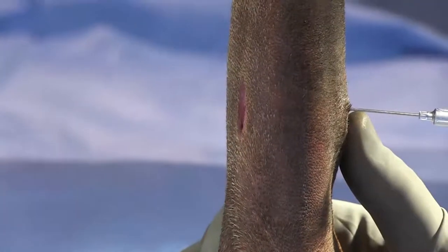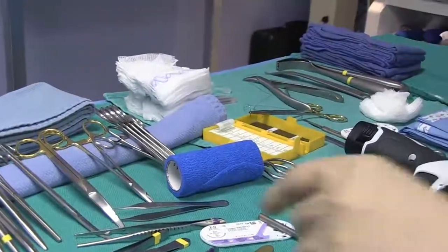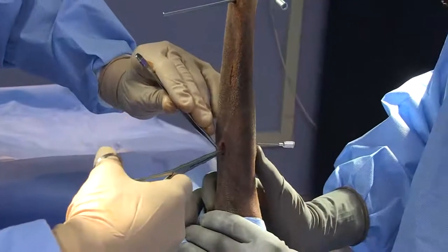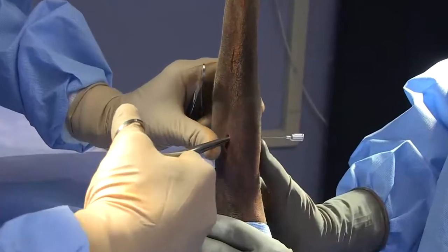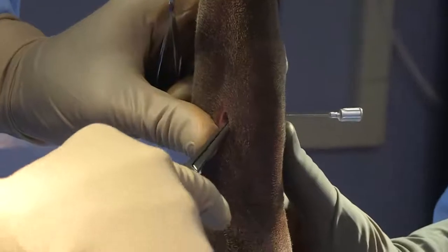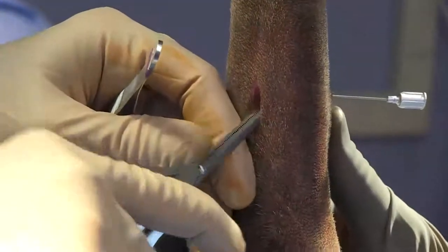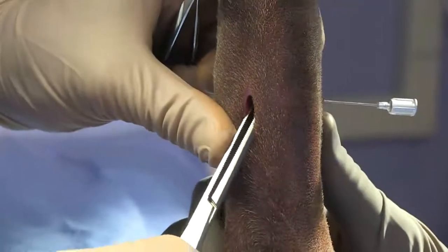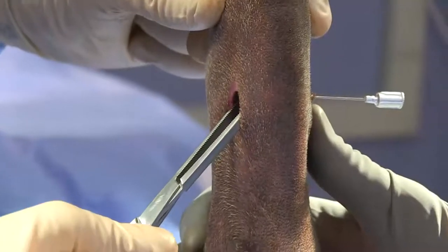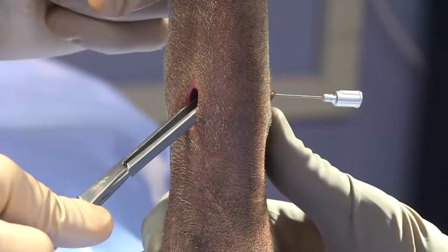Proximally there's quite a bit more soft tissue, so it's quite important to make a large releasing incision so that you can bluntly dissect through those soft tissues down to the bone and have a good view. This will also help you avoid getting your drill engaged in those soft tissues. We've got our skin incision — next we'll grab either some hemostats or Metzenbaums, and develop this plane between the muscle bellies until we're down on the bone.